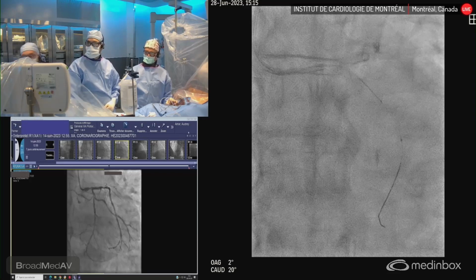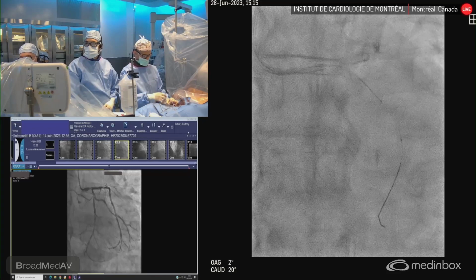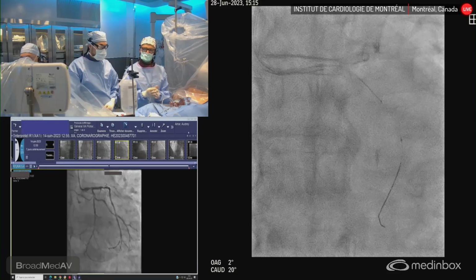Is the IVUS working? For a patient who cannot support lying down to do the procedure, in a more quiet atmosphere. But now you cannot hear him. He's asleep. He's doing well. The saturation is okay. The blood pressure is okay.